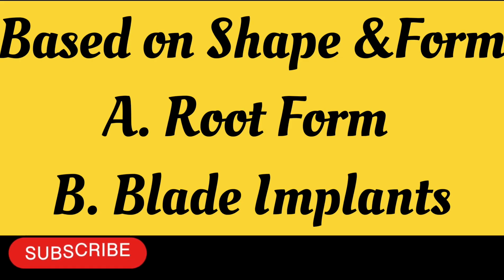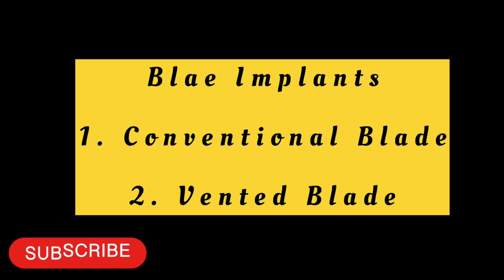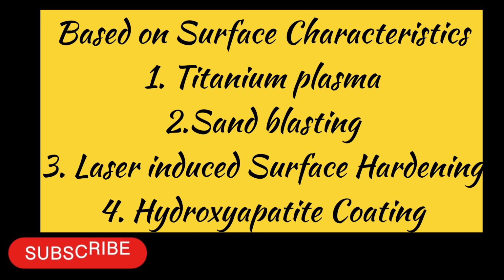We can also classify dental implants based on shape and form, for example root form implants and blade implants. In root form implants, we have solid tapering type, cylinder type, pin type, screw retained type, basket type and hollow cylinder type. And in blade implants, we have conventional blade design and vented blade design. Based on surface characteristics, we have titanium plasma sprayed coating, sandblasting, surface etching, laser induced surface hardening and hydroxyapatite coating.